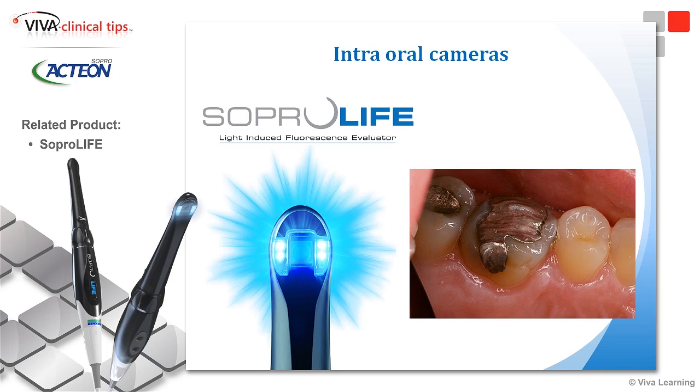I just did that yesterday where we had a tooth that had a fractured cusp and we had to do a gingivectomy. And I showed the patient the reason that we needed to take the laser and remove some of the gingival tissue because they didn't understand why. Well, you just fixed the tooth, doc. Well, yeah, I'm going to fix the tooth, but in order to fix the tooth properly, I have to remove some of this excess gum tissue that came over the tooth. They see the picture, they understand it, they accept the treatment.